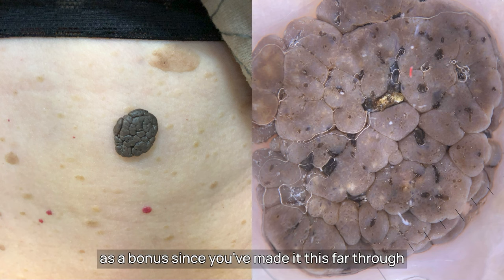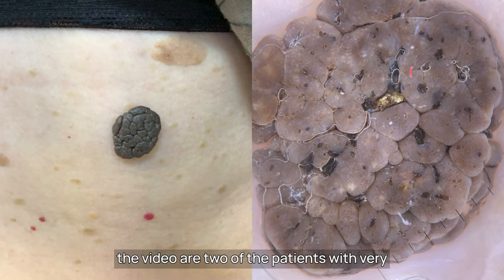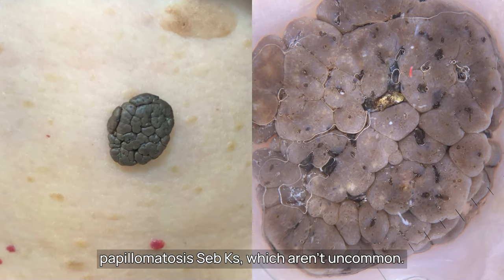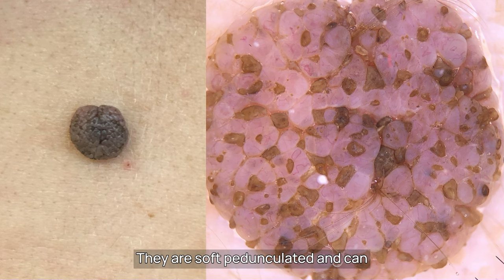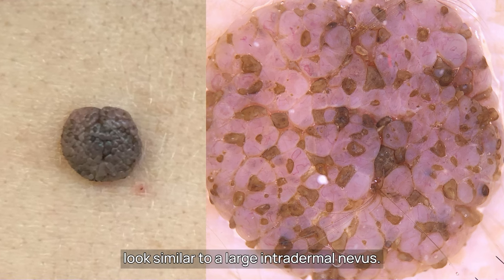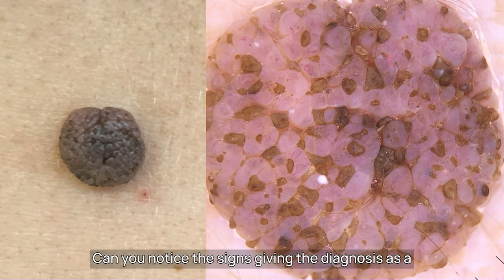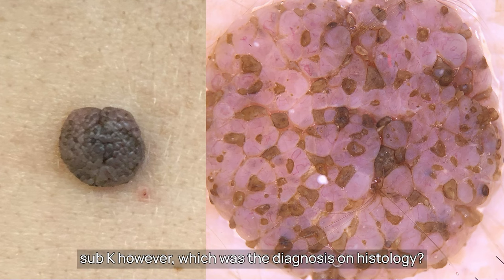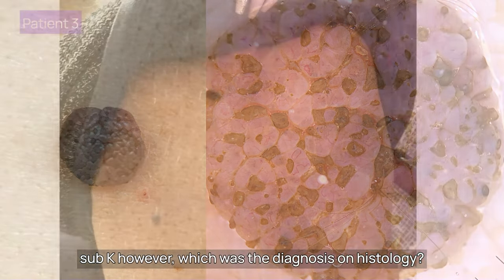As a bonus, since you've made it this far through the video, here are two other patients with very papillomatous Seb Ks, which aren't uncommon. They are soft, pedunculated and can look similar to a large intradermal naevus. Can you notice the signs giving the diagnosis as a Seb K? Which was the diagnosis on histology?